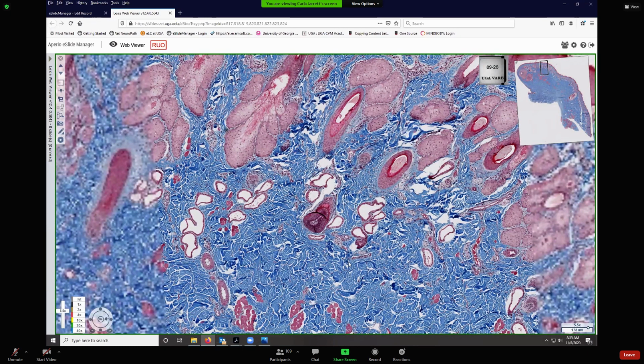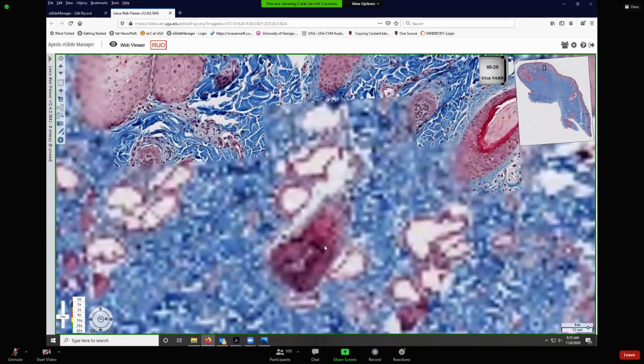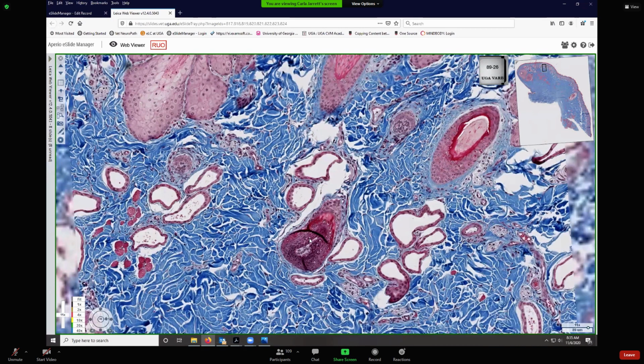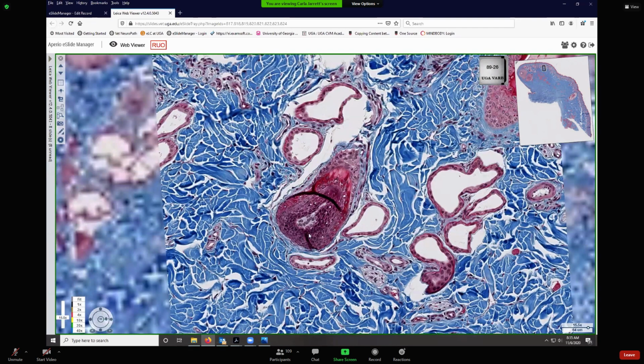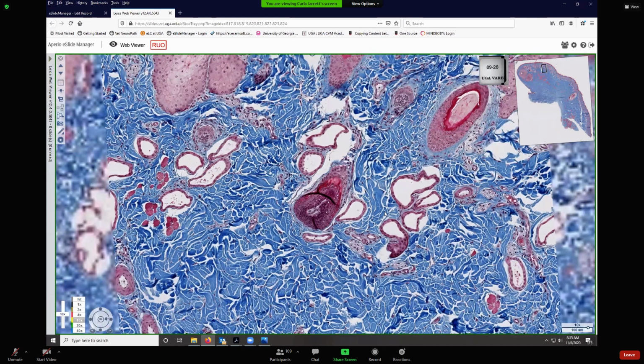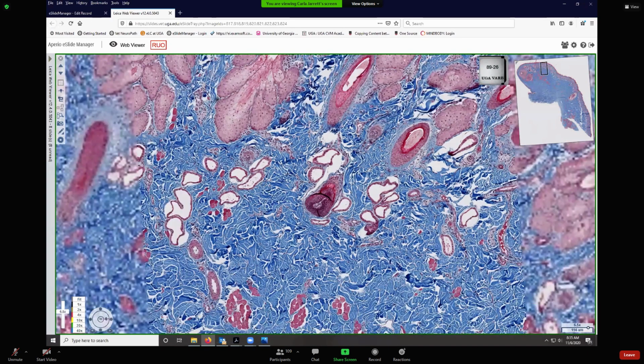Now the pigment of the hair will come, remember the melanocytes reside in that stratum basale. So that's why the hair matrix cells, which is also called the hair germinal epithelium down here, will often stain pretty dark or have a lot of melanin in them, because that's where the pigment comes from. Those melanocytes that are in that stratum basale of the hair bulb.